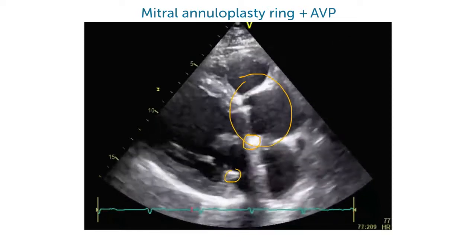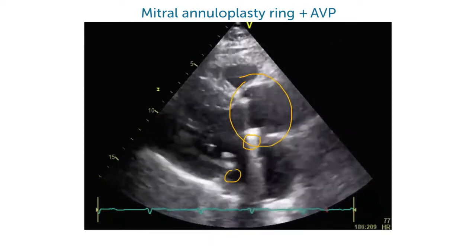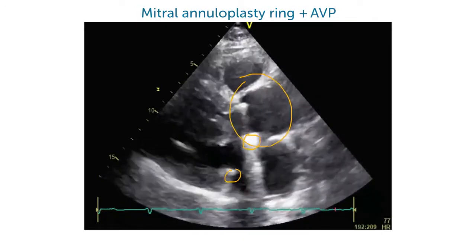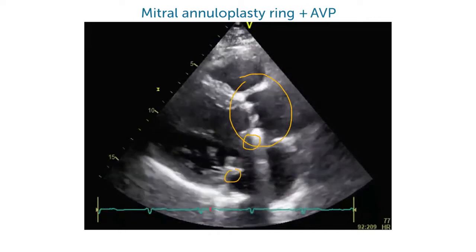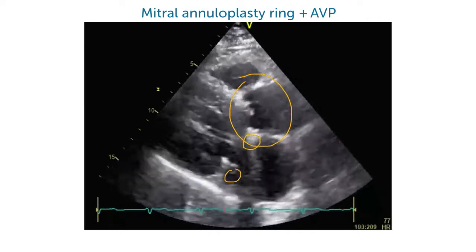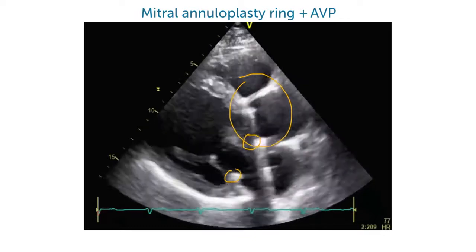It's a patient of mine, actually, who was operated and everything went fine, but a number of weeks after the operation, somehow a suture must have opened and he developed very severe mitral regurgitation. You can see part of the leaflet, again, prolapsing into the left atrium. A very difficult pathology indeed, but some pathologies are very easy to detect.